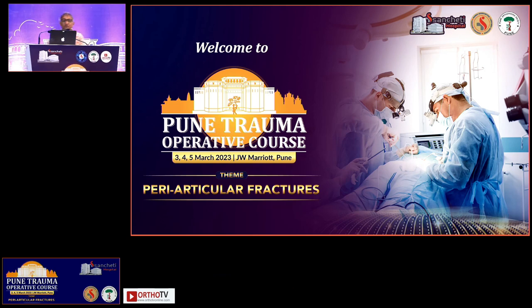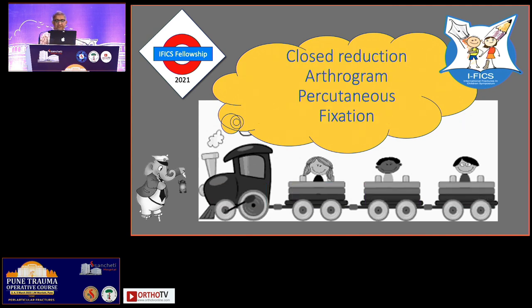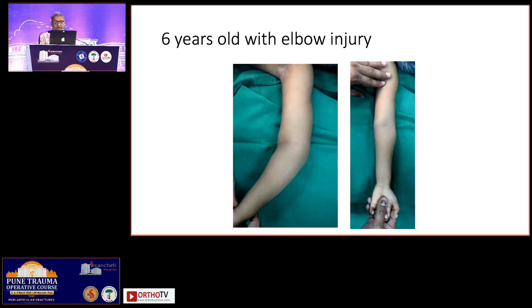So quickly, I'm going to show you three techniques. A lot of people have been asking since yesterday how to do these. The first technique is closed reduction, arthrogram and percutaneous fixation for a Jakob 1 or 2 lateral condyle fracture.